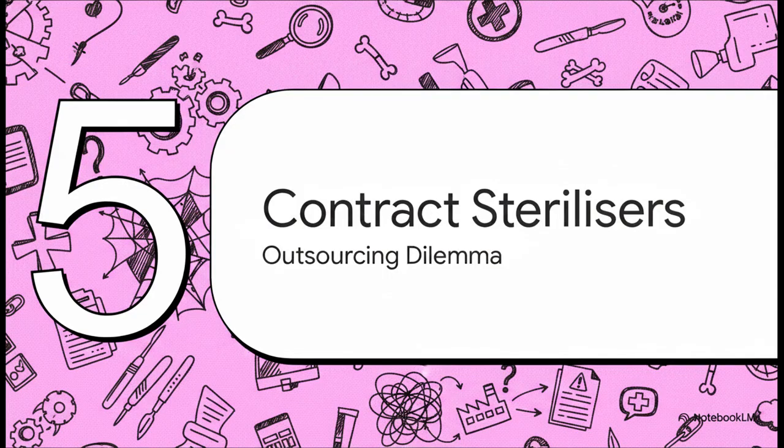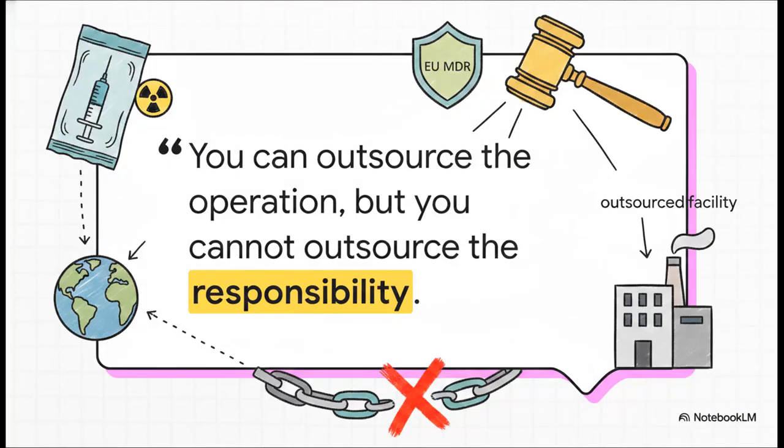Section 5. Managing Contract Sterilizers. The Outsourcing Dilemma. I really want to let this next statement sink in. You can outsource the operation, but you cannot outsource the responsibility. Under EU MDR law and global regulations, the manufacturer placing the device on the market holds the ultimate, undeniable legal accountability for its sterility. Listen, it absolutely does not matter if a contract facility on the other side of the world was the one who pushed the button. At the end of the day, the responsibility is entirely yours.